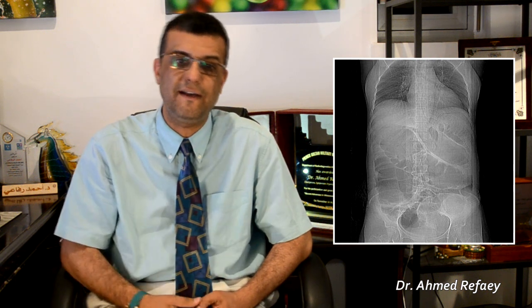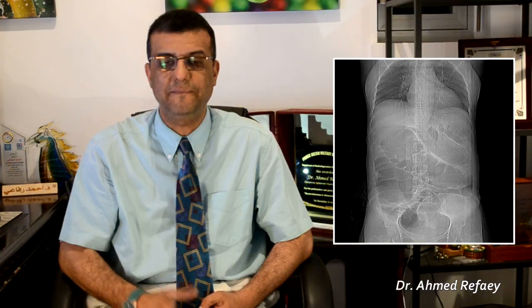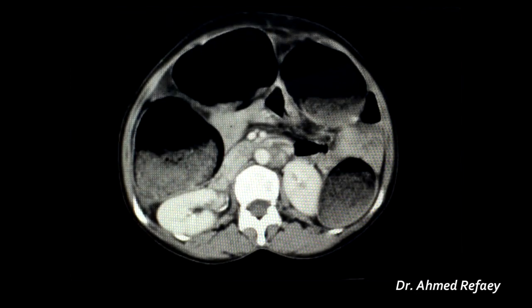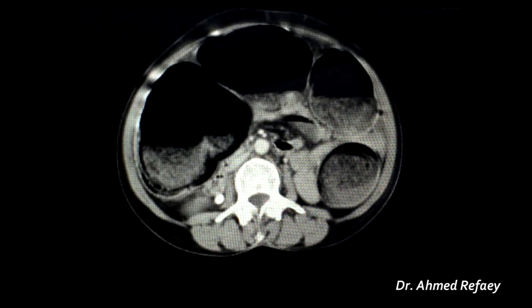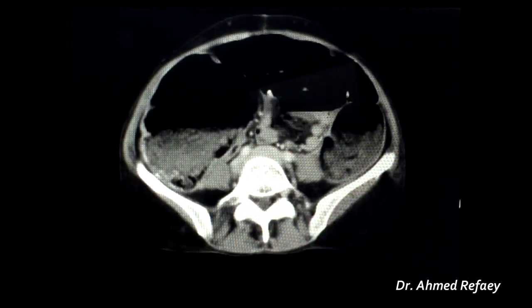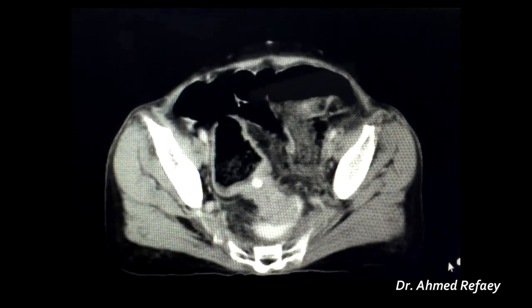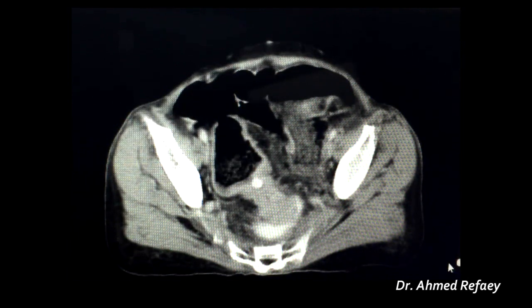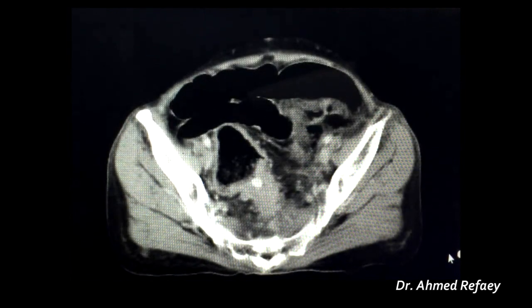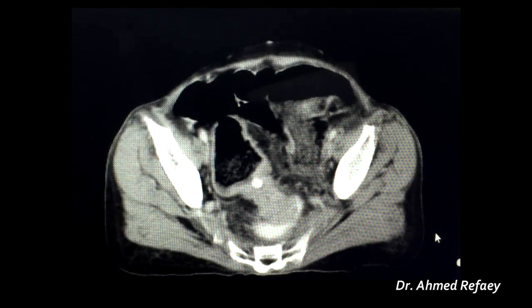Case number two: another elderly patient with large bowel obstruction. The supine plain radiograph reveals marked large bowel dilatation with characteristic incomplete folds not crossing the lumen. CT with intravenous contrast shows marked colon dilatation with internal fecal matter. Tracing the dilatation leads to the rectosigmoid junction, where circumferential wall thickening over approximately five centimeters causes near-complete luminal obstruction, confirmed by biopsy as adenocarcinoma.